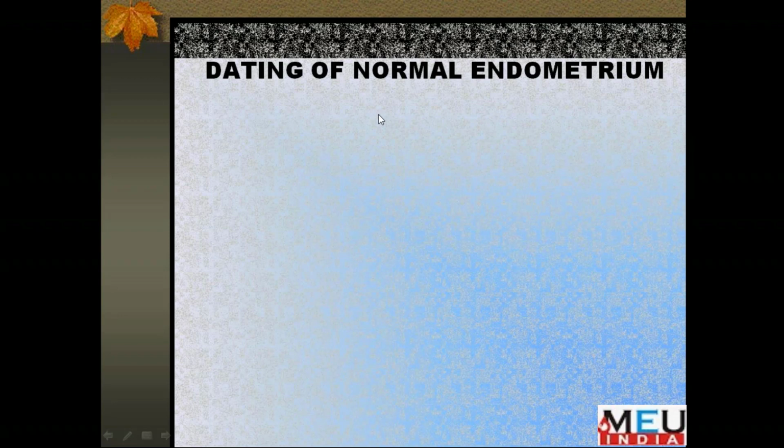Today we will be discussing the dating of normal endometrium, and along with this the dating of the endometrium.